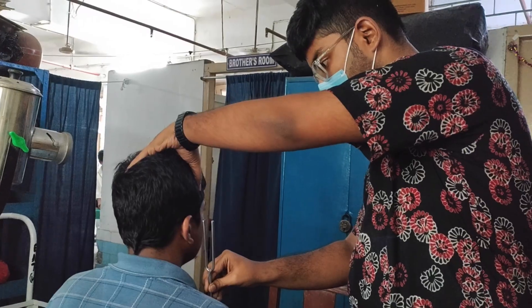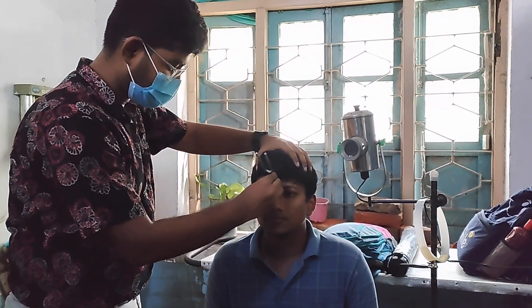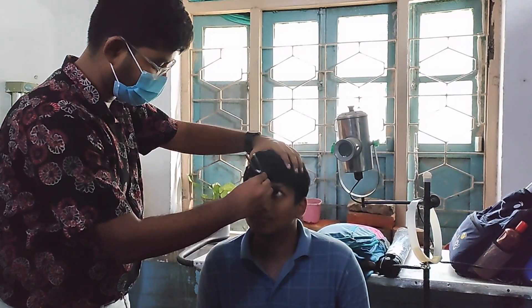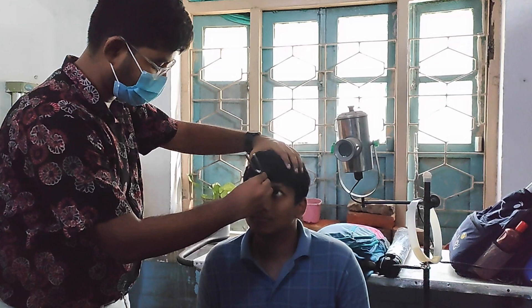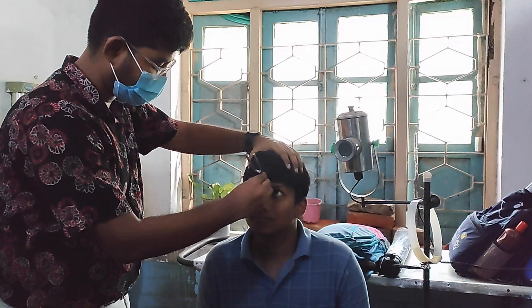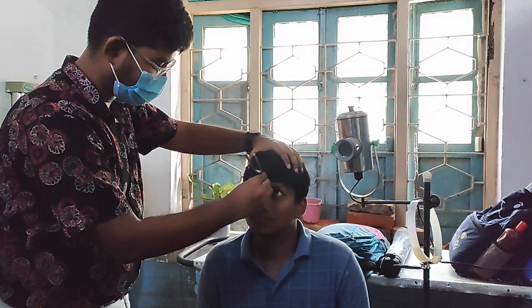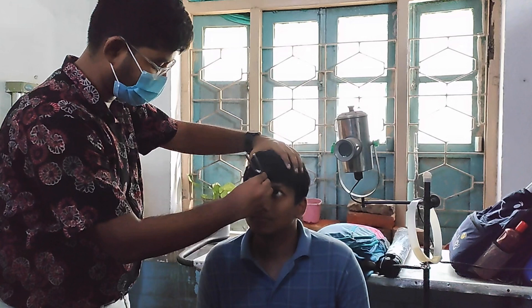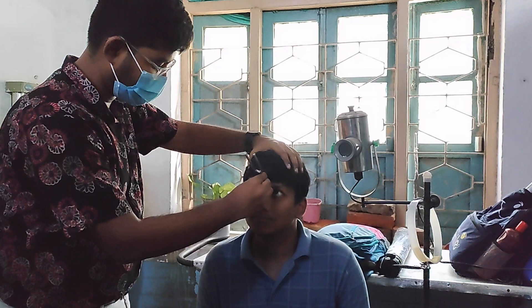Moving into the Weber's test — after setting the tuning fork into vibration, we place the tuning fork on the glabella of the patient. We can place it on any midline bony prominence from the glabella to the occiput, but never on the symphysis menti, because the symphysis menti is on the mandible. Sound transmission would then have to go through the temporomandibular joint, reducing bone conduction. It is better to avoid the symphysis menti. Preferably place the tuning fork somewhere between the glabella and the hairline on the forehead.